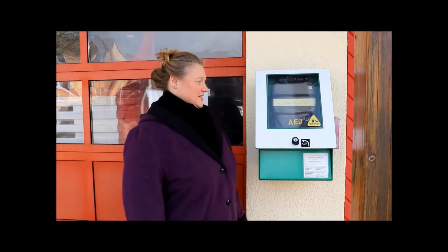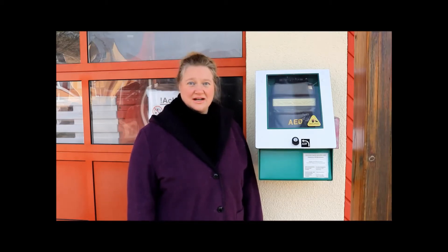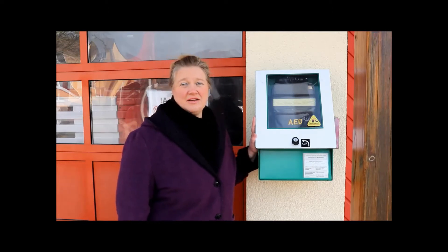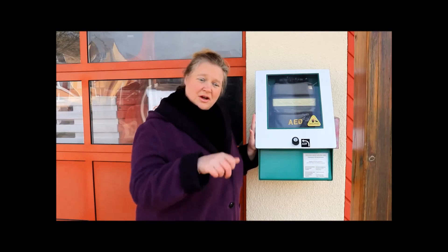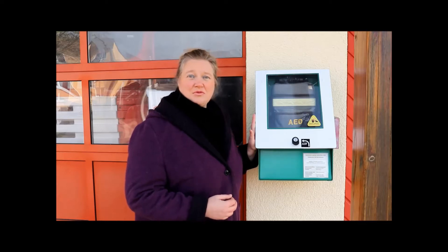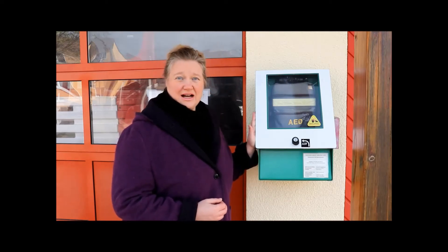Wann setze ich ein solches Gerät ein? Ihr dürft den AED immer dann einsetzen, wenn ein Mensch bewusstlos geworden ist. Es gibt eine kleine Einschränkung: Die meisten Geräte im öffentlichen Raum sind erst für Personen ab neun Jahren geeignet. Im Bereich der Schwimmbäder oder Sportplätze gibt es Geräte, die man umschalten kann. Da ist ein kleiner Plastikschlüssel drin, den steckt man in eine Öffnung, und dann schaltet das Gerät automatisch auf die Reanimation von kleinen Kindern um.